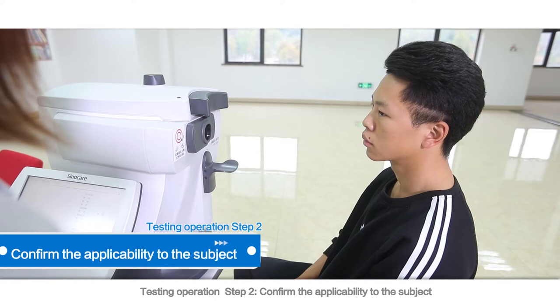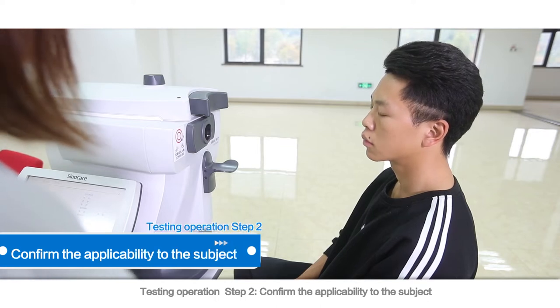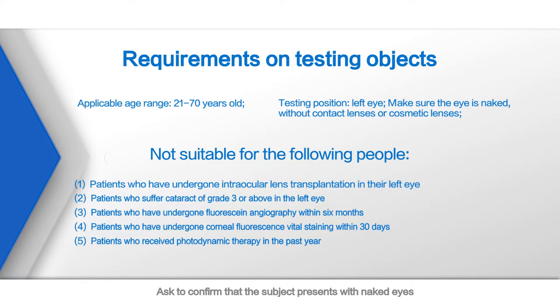Testing Operation Step 2: Confirm the applicability to the subject. Ask to confirm that the subject presents with naked eyes. Confirm that the subject hasn't taken any operations on her or his left eye, suffered no cataract, and recently received no treatment. Refer to the requirements on testing objects for details.